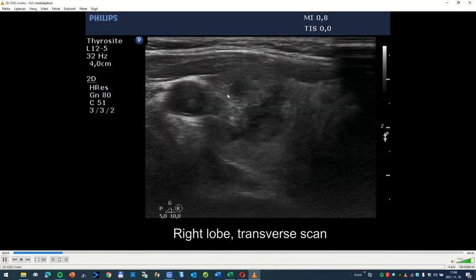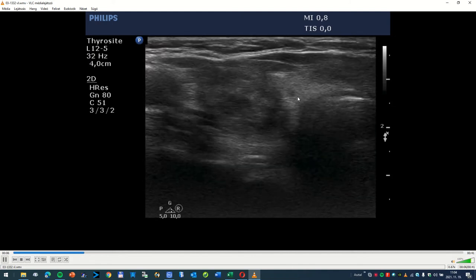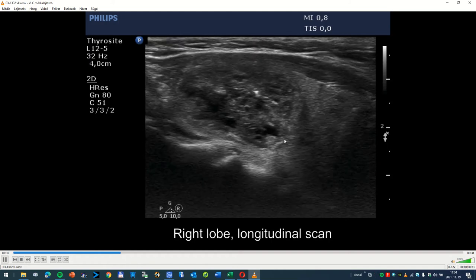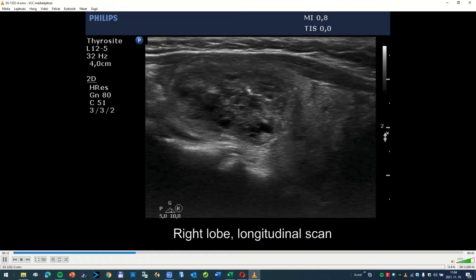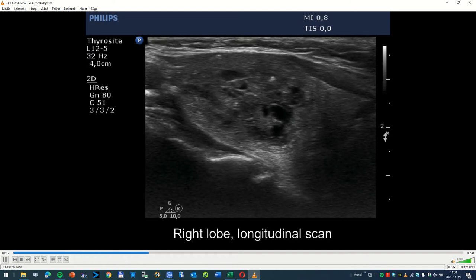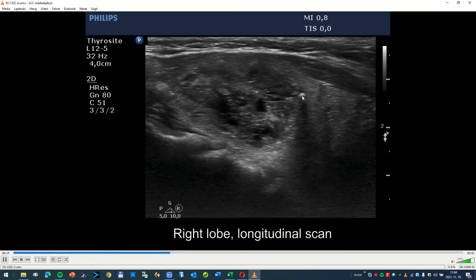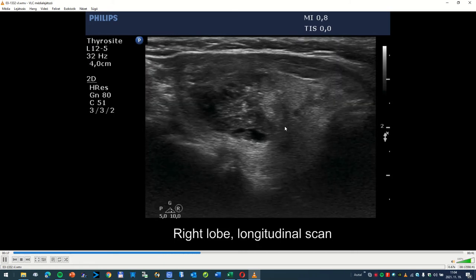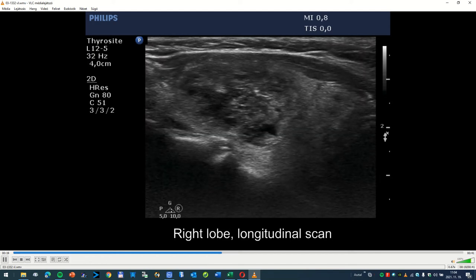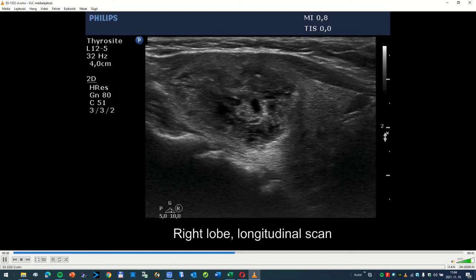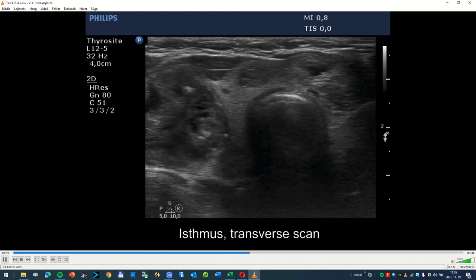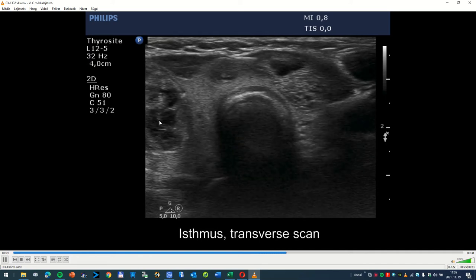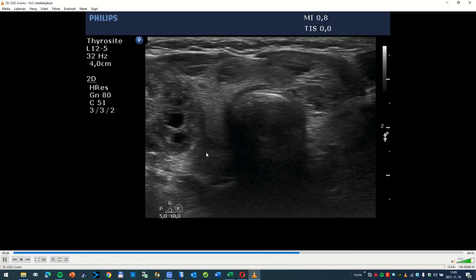So if we see only this nodule, we had much more concern compared with the situation where we analyze the entire thyroid. It is very likely that these hyperechoic figures in question are really not microcalcifications. Not an absolute proof, but the presence of other cystic lesions decreases the likelihood that these figures are microcalcifications.